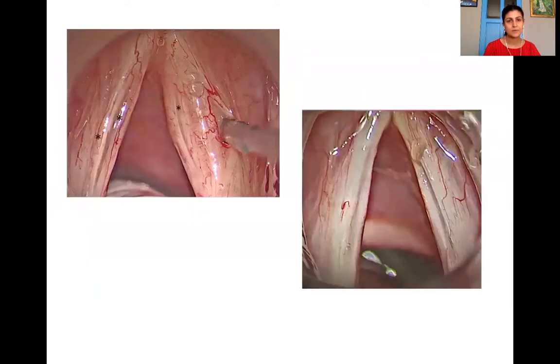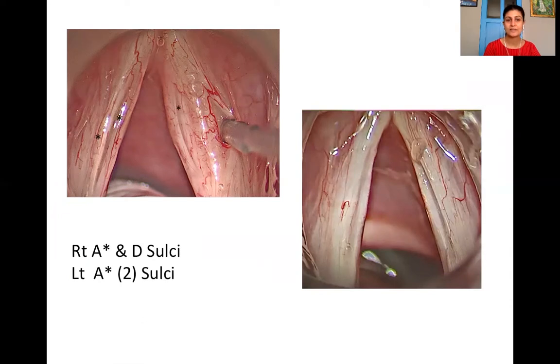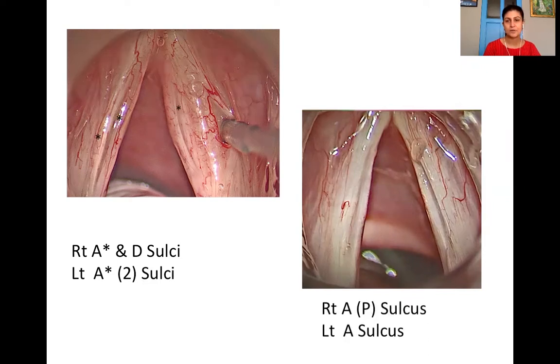To give an example, on the left side of your screen, on the right vocal fold there is a type A and a type D sulcus. On the left vocal fold there are two type A sulci. On the right side of your screen, you see another patient who has a right type A(P) sulcus because the polyp is emanating from within the type A sulcus.